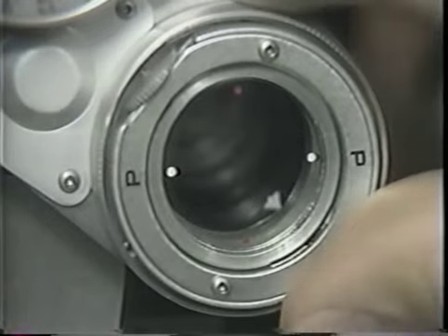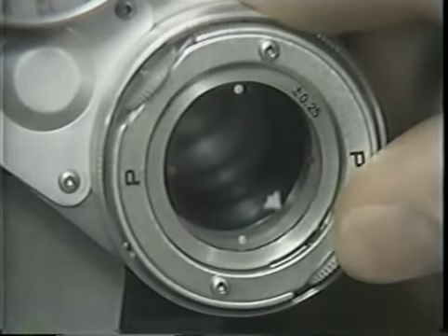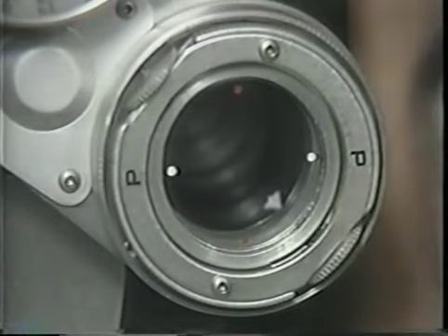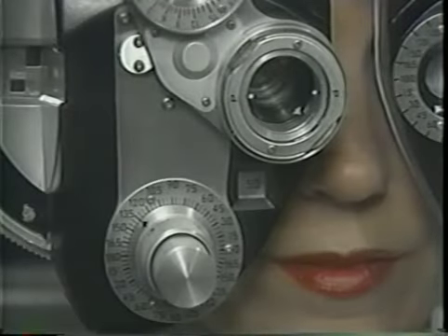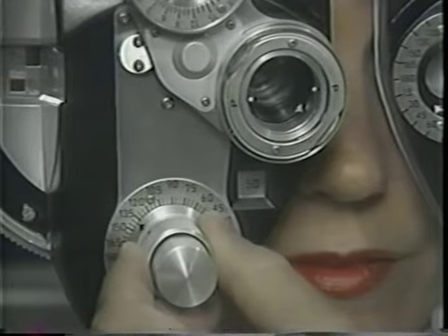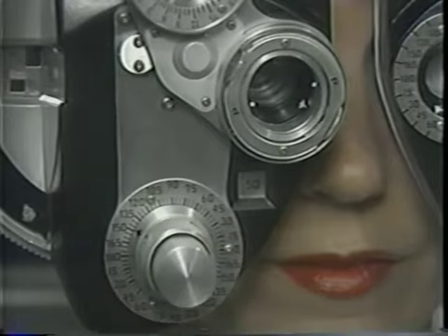Now which is better, 1 or 2? 1 or 2? 2. Good. The cross cylinder is left in the preferred position, and the cylinder axis is moved 5 or 10 degrees toward the corresponding axis of the cross cylinder. Notice that the cross cylinder rotated 2, remaining synchronized with the cylinder axis.